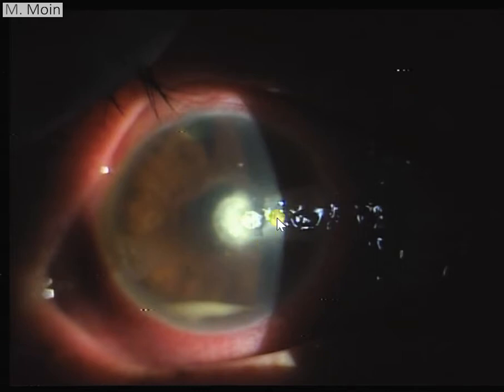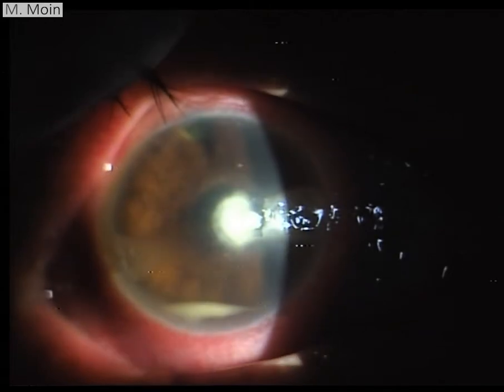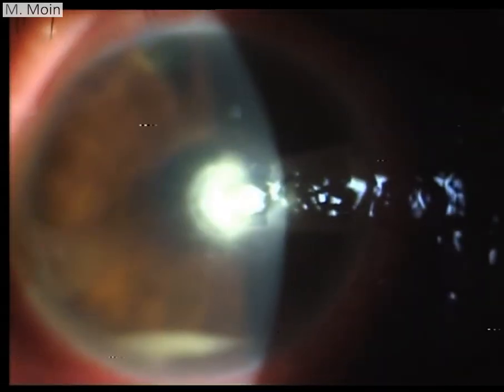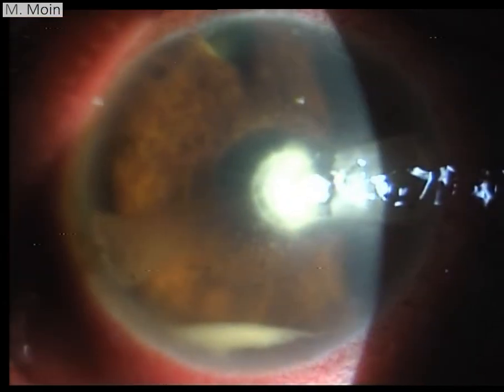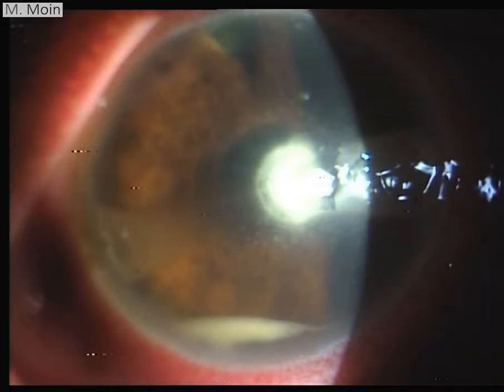You can see the corneal reflex is pretty dull in this patient because of the corneal ulceration. This is the slit beam. This was diffused. We go to a higher magnification and look at the ulcer in detail. So what actually happens in an ulcer is normally in the center you would have that dead-ish tissue where the fight actually has subsided or is subsiding, while this is the active area.